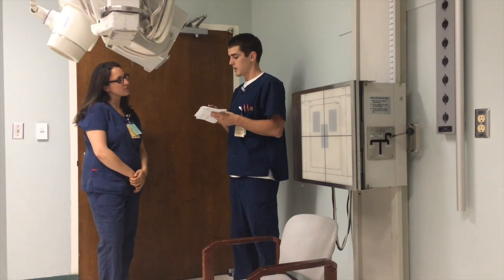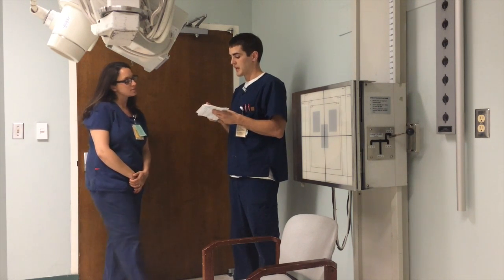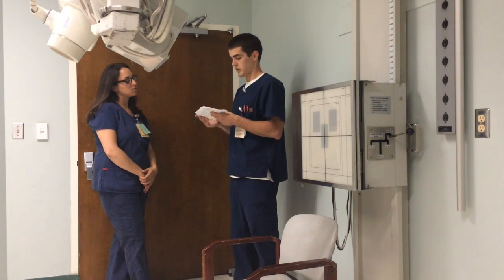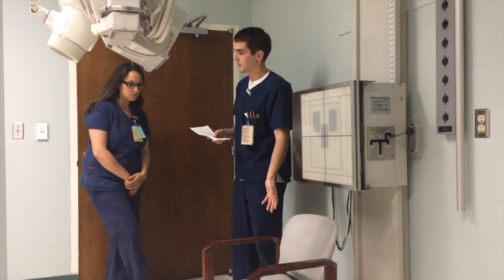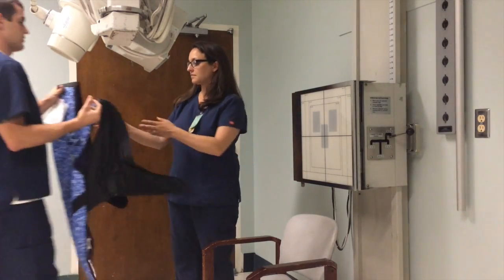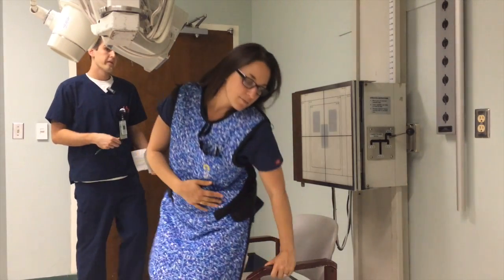Okay. Have you had any x-rays before on this area of the face? No. Any surgeries or anything? Any personal history of cancer? Okay. So we're just going to do 3 images. So if you want to go ahead and grab a seat, I got some shielding for you. Help protect you from excess radiation.